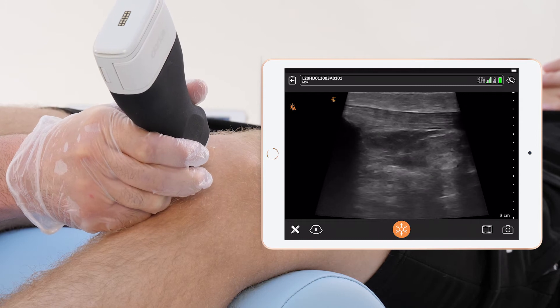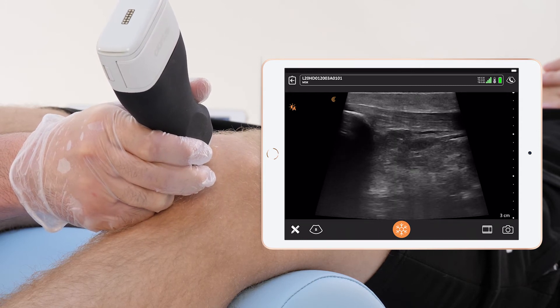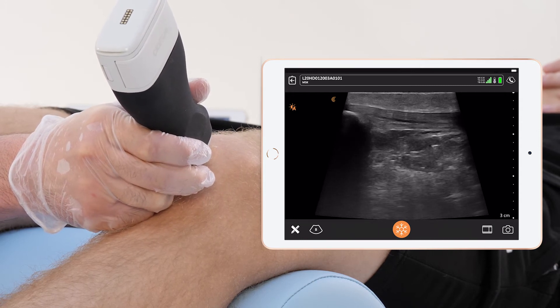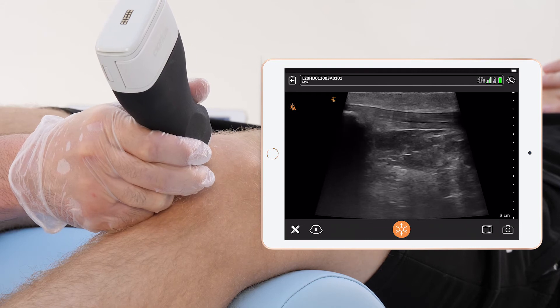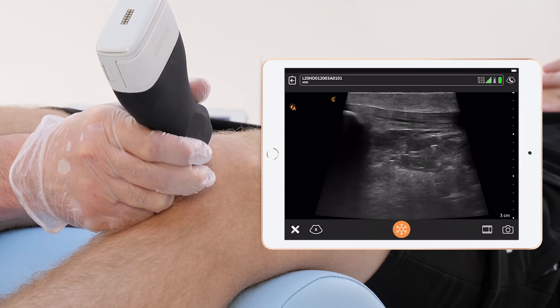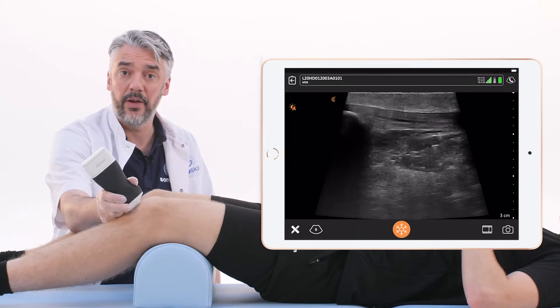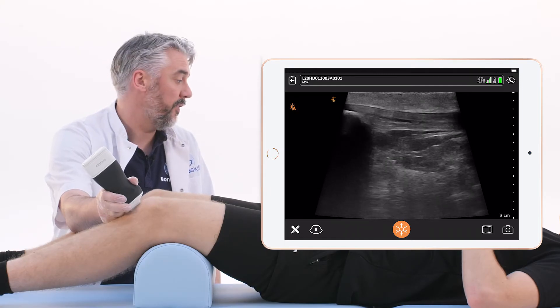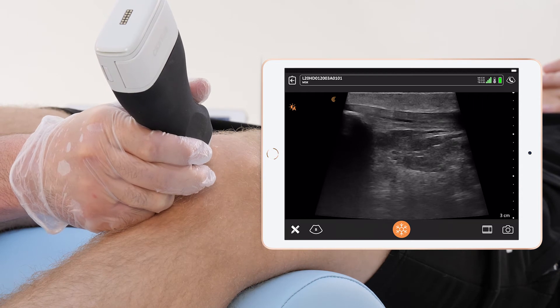In this case we can see that there is a little injury. We can see a hypo- to anechoic zone in the middle of the tendon. So this seems to be a partial tear — a longitudinal tear of the origin of the patellar tendon.